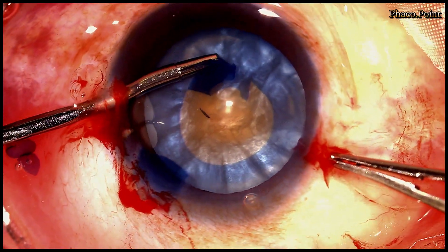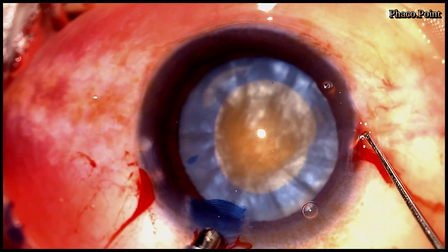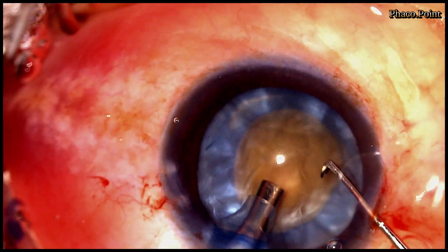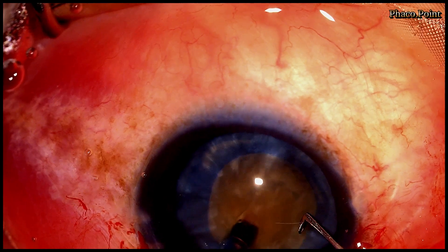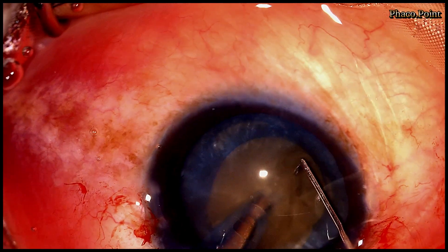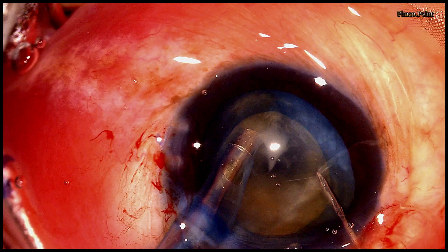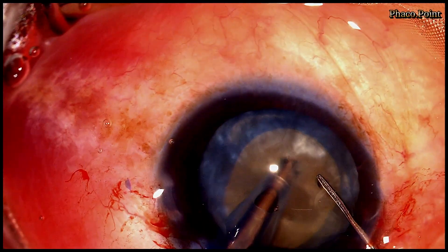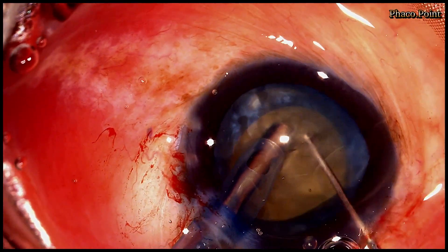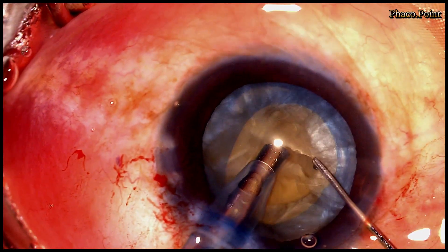In almost all cases of intumescent cataract, because the anterior chamber has been decompressed, I do not perform a hydrodissection procedure. We proceed directly with the downsizing and emulsification of this nucleus using the direct chop technique. I use burst mode to impale and get a good hold of the nucleus, whilst my long chopper mechanically divides the nucleus into two hemi-nuclei. Each hemi-nucleus is then subsequently downsized, and when we have an adequate number of smaller emulsifiable fragments, each fragment is drawn up into the pupillary safe zone, downsized further, and emulsified.